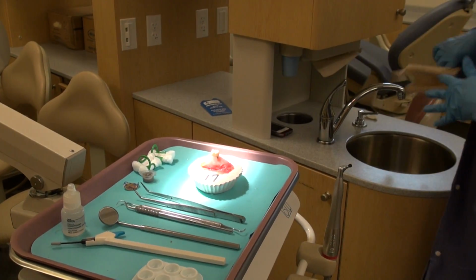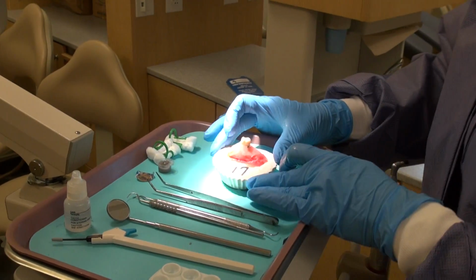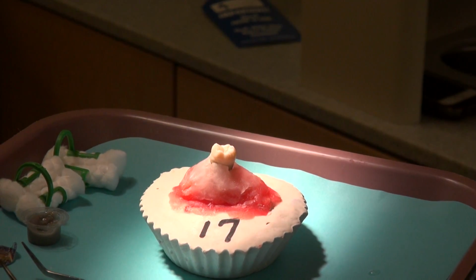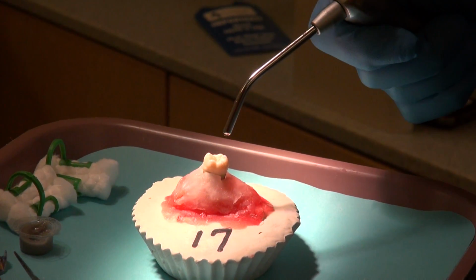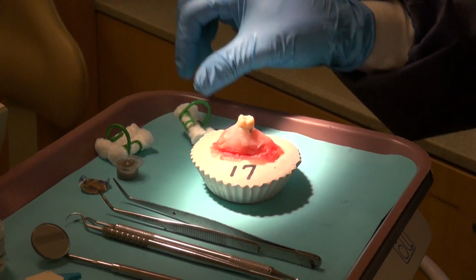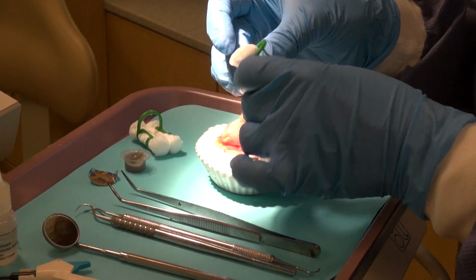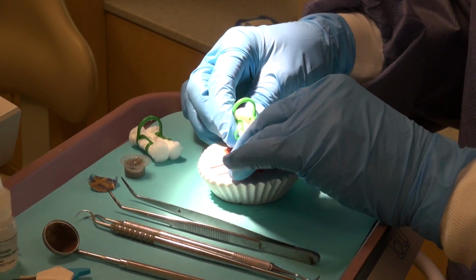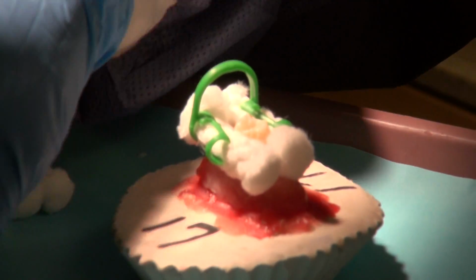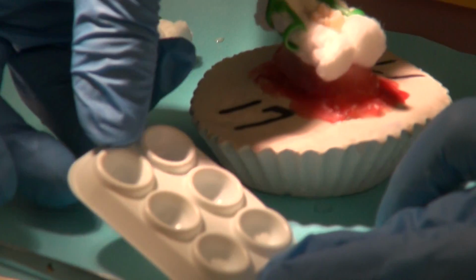Okay, so we take a look at our tooth, and we see that it's nice and cleaned off. Little bit of air. Double check. And now isolate. We want to have 2 sets of cotton roll holders set up because the first step, we're going to isolate the tooth to place our acid etch, our phosphoric acid liquid, in this little well.